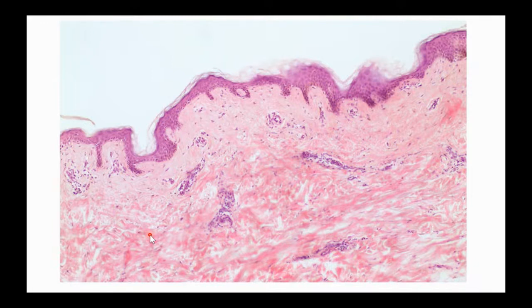We have looked at all of the connective tissues and all of the epithelial tissues in the body. Several of those types of tissues we could find in the skin. Remember that we had a type of tissue we found in the epidermis, a type in the papillary layer of the dermis, and a type in the reticular layer of the dermis. Going into next week, as we start talking about the skin, we're going to want to practice identifying some of those types of tissue on images of the skin.